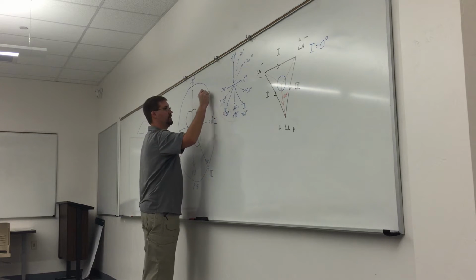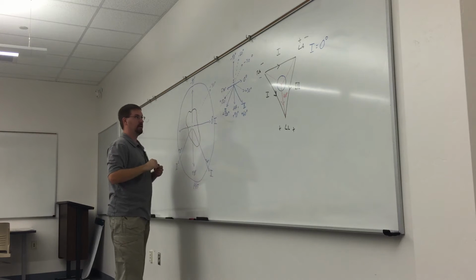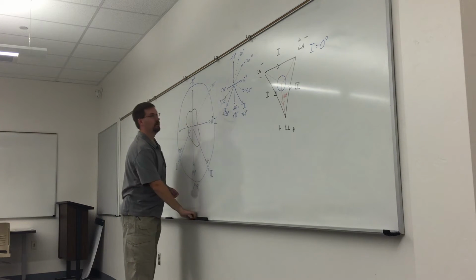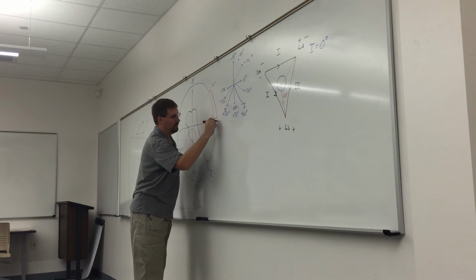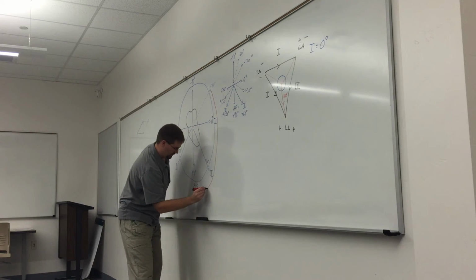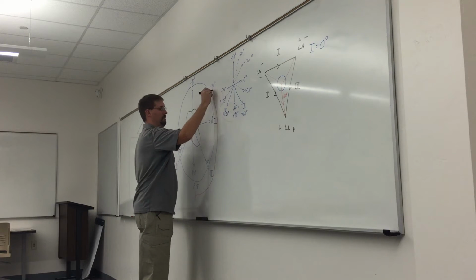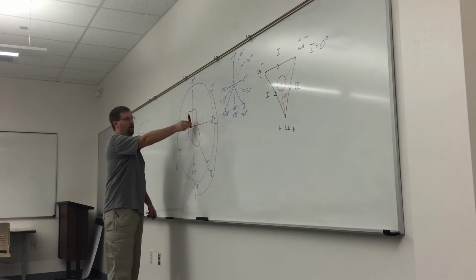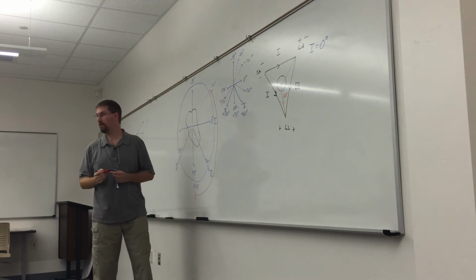I'm going to put an invisible line here at -30 degrees. You guys cool with that? -30 to +90. If that arrow is in this range here, this is considered normal. You guys okay with that?